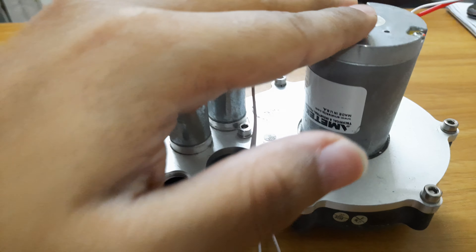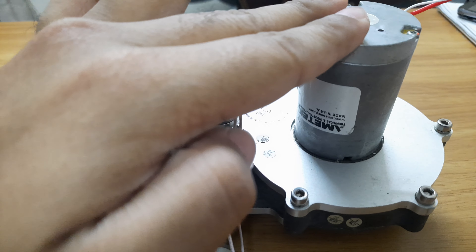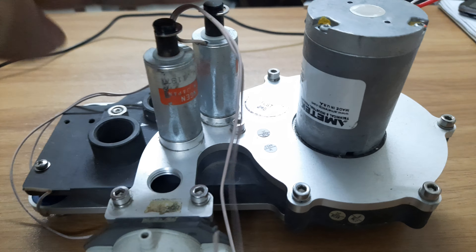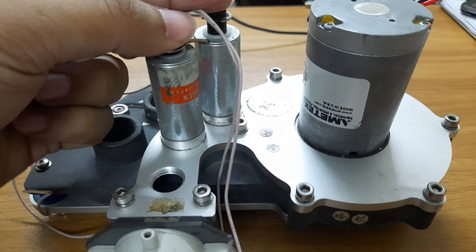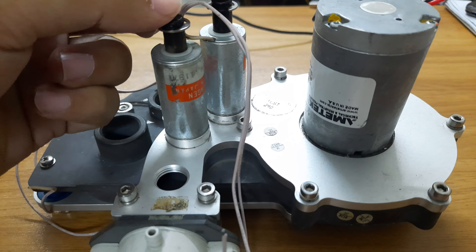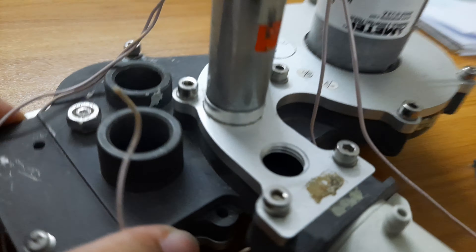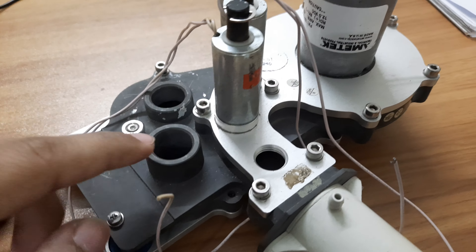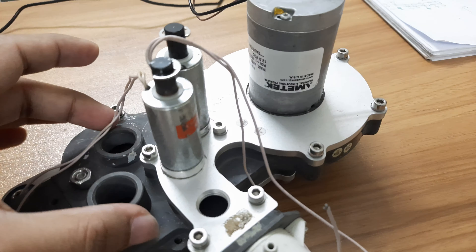So there are two kinds of control here: one is varying the RPM of the motor, and another is switching the actuator, which works as a solenoid and acts as the pressure release mechanism. Here is also the oxygen and air inlet port.